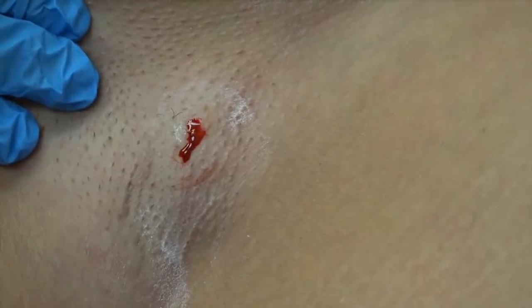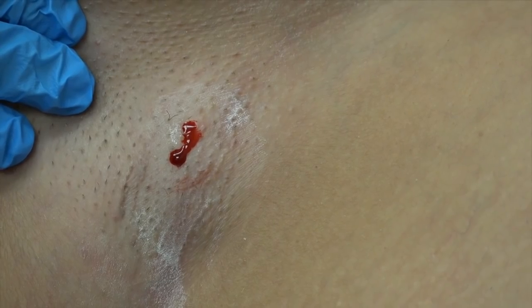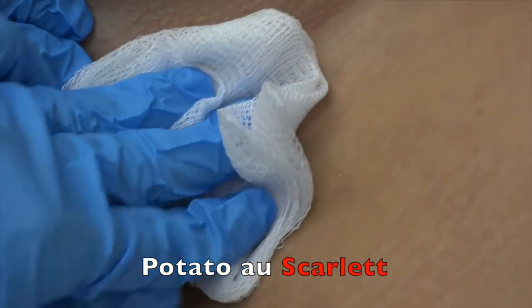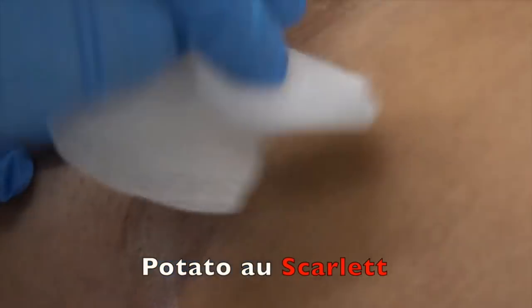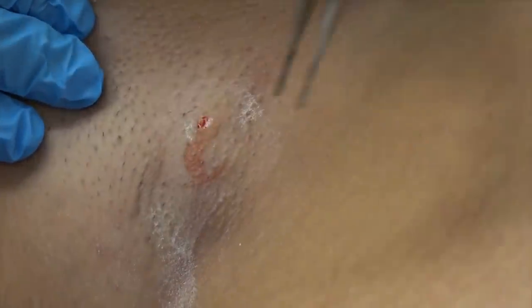So how do you - don't stick yourself. Is this the first time she's doing a stitch? Yes. Oh goodness gracious. I tried to get her to practice on a potato and you know what she said? She said Scarlet's like a potato. She called you Scarlet Papas, which means Scarlet Potato.